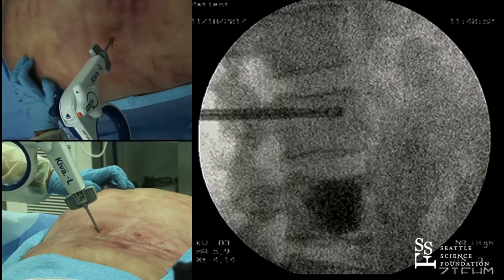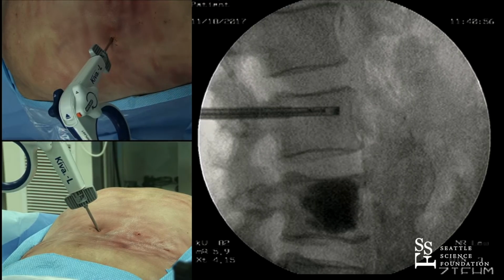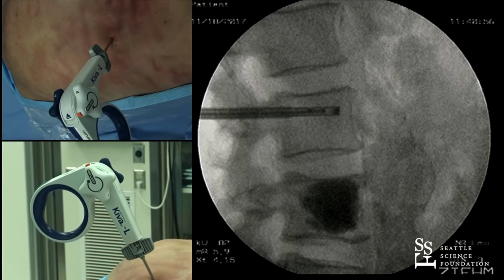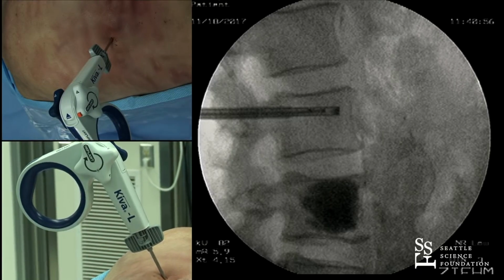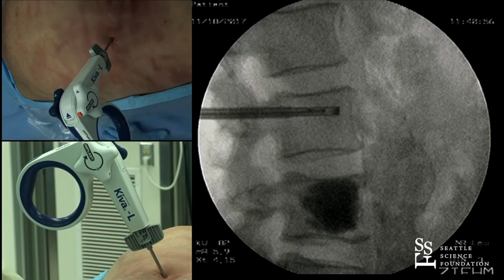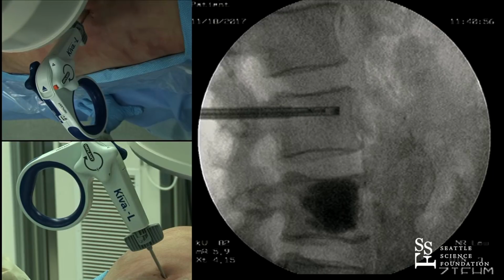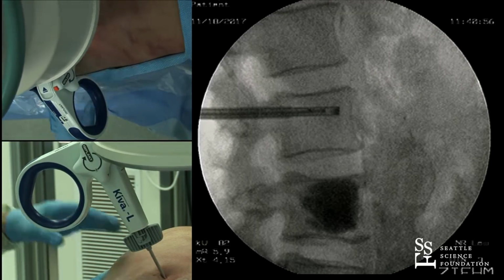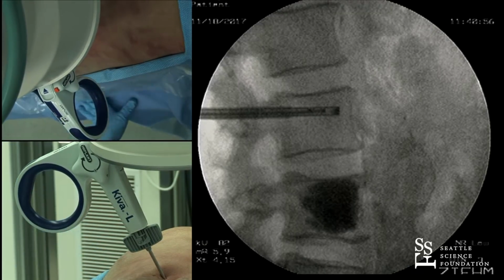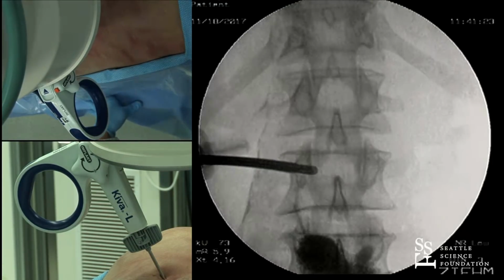As a nod to Dr. Schonard, we are going to check the medial lateral view. So we're coming back AP, which we would do absolutely anyway to make sure, before deployment of the nitinol coil, that we're in the center of the vertebral body between the pedicles. Technically, as long as you're between the pedicles, it doesn't matter whether you're dead center or 5 to 7 millimeters to either side of dead center. It just matters that you're between the pedicles, because that's where the biomechanical support primarily occurs.